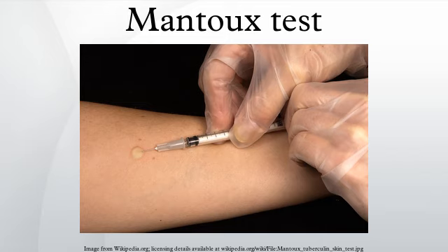5 millimeters or more is positive in an HIV-positive person, persons with recent contacts with a TB patient, persons with nodular or fibrotic changes on chest X-ray consistent with old healed TB, patients with organ transplants, and other immunosuppressed patients.